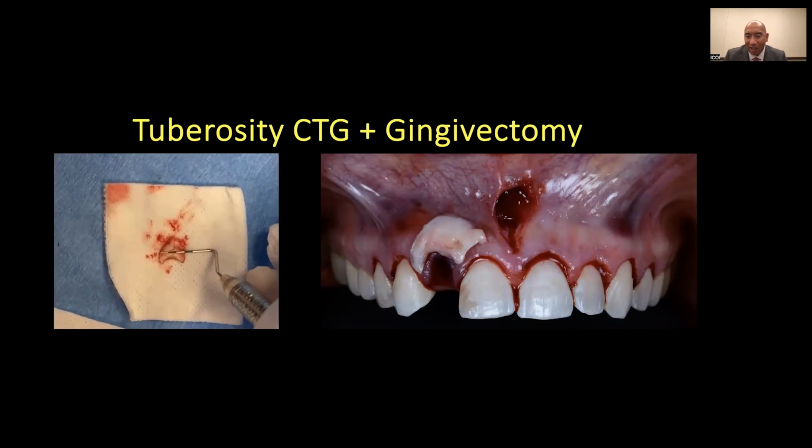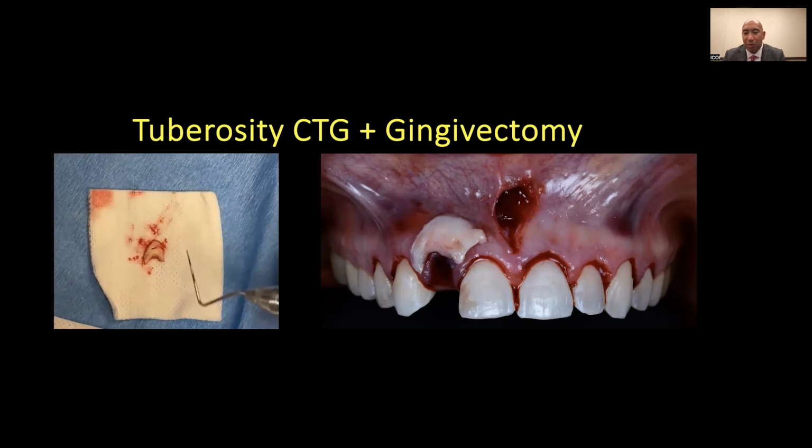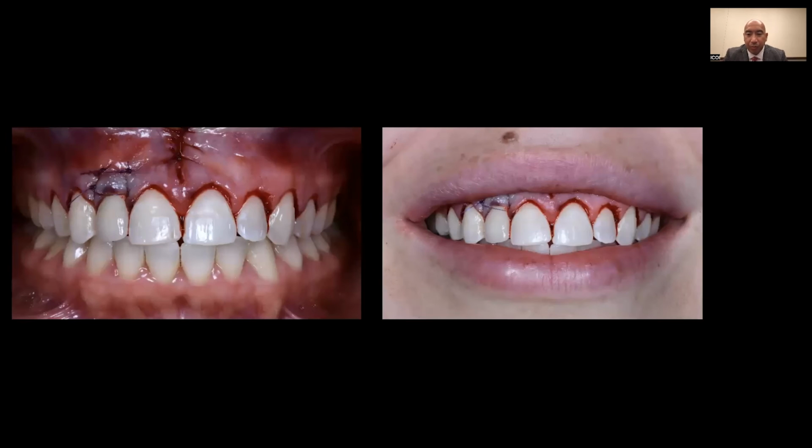And then on the left side, we did some crown lengthening to give her a little symmetry, so we could also fake it in case we couldn't graft all the way down and make number 7 totally normal. So here's the abutment, and then we've released that tissue through that frenum attachment. That was my tunnel approach, utilizing the frenum. And then we used a sulcular approach on the other side so that we could crown lengthen the teeth and reduce the bone so that the tissue stays lengthened.